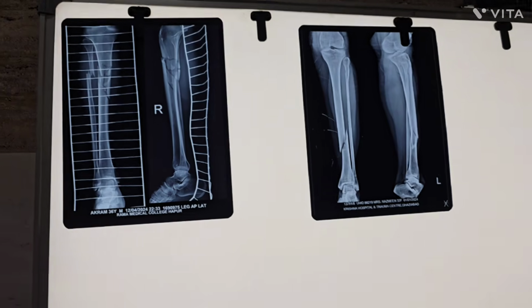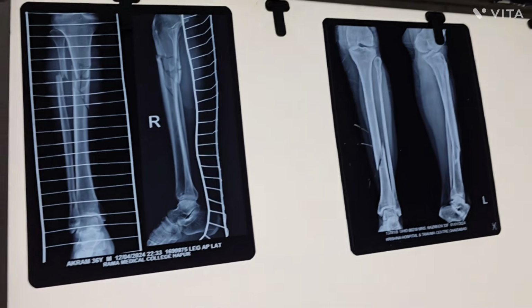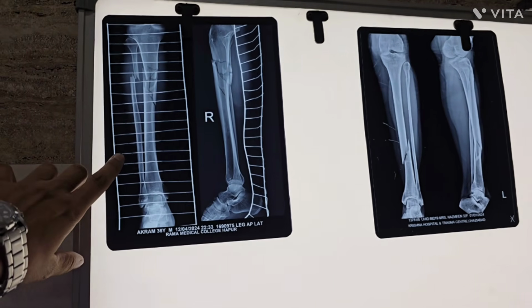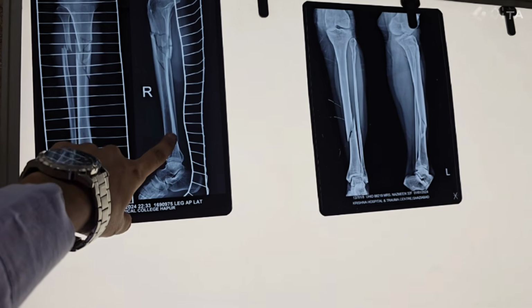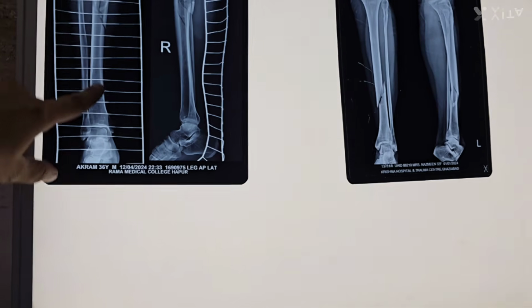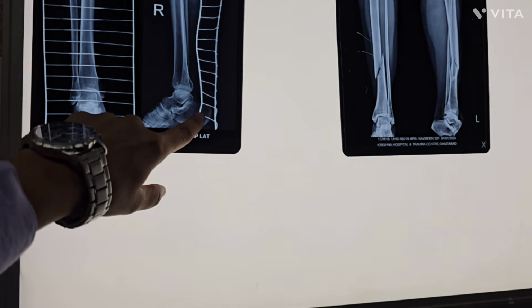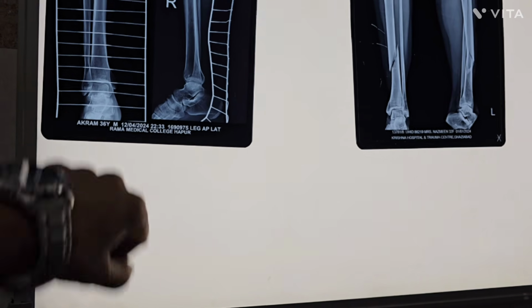Okay. So now come to the leg fracture. In this you can say it like this: this is a skeletally mature X-ray of the leg taken in AP and lateral view with adequate exposure, supported with a Kramer wire, showing the tibia, fibula, talus, calcaneum and part of the metatarsals and tarsals.